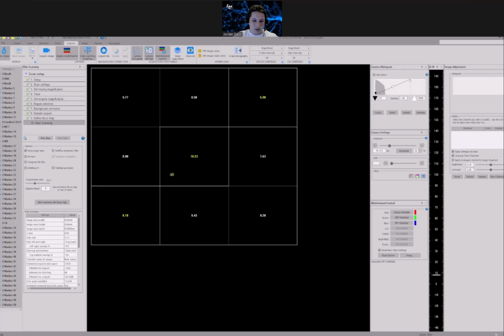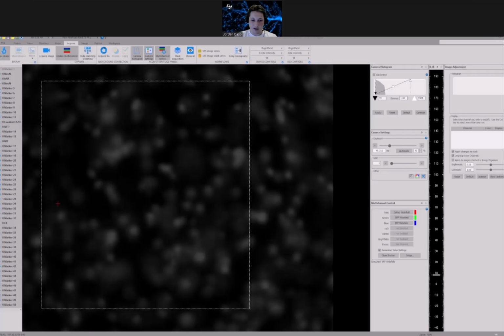As we move on here, before starting our scan, we can also review this final step for our key information. Since 3D slide scans can be much larger, I find this to be a good time to double check the estimated required storage size for the scan. Additionally, you can also enable stitching to help get that crisp aligned final result in your image. As we get started, just as another note, 3D slide scans can take much longer than 2D scans as the system is taking many more images.